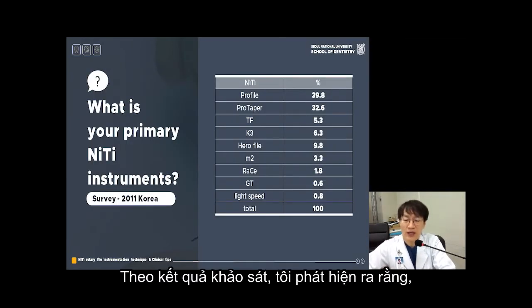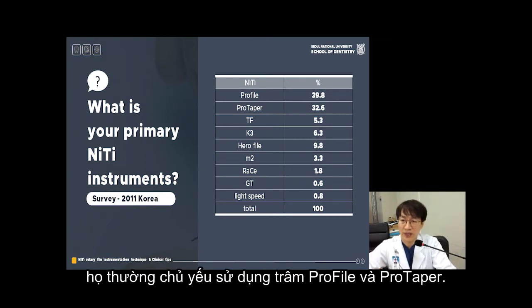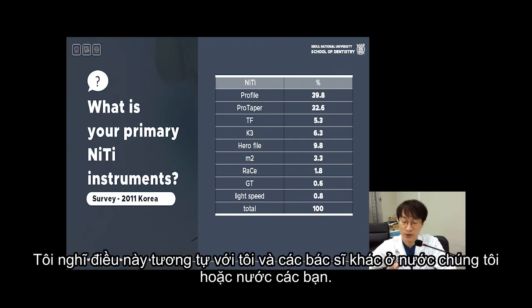According to the survey, I figured it out. It was also 10 years ago, but they usually primarily use ProFile and ProTaper files, which is similar to me or other doctors in our country or in your country, I think.